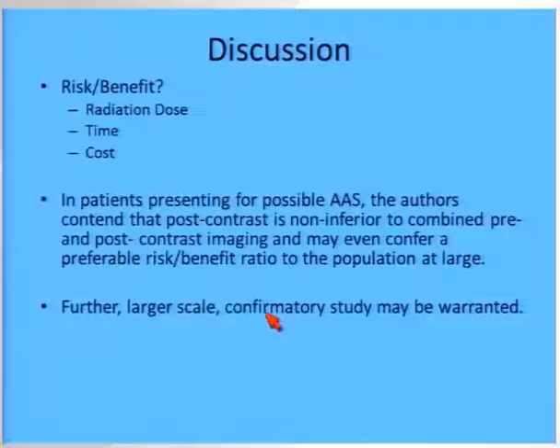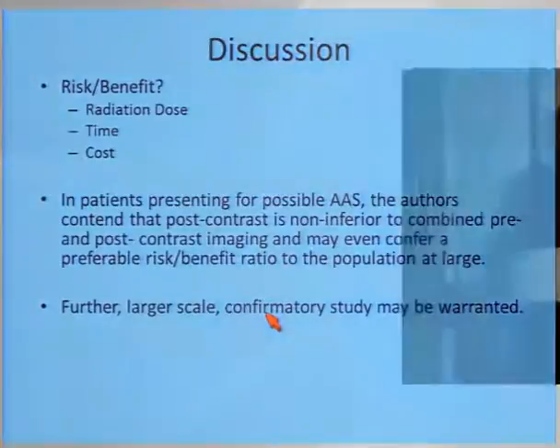I actually have a couple. The same question that we had asked Chris: did you look at the distribution of the intramural hematoma? Because sometimes the type A is a lot easier to see on the non-con. I was also struck by the fact that you said you had 5 thoracic radiologists who are fellowship trained. In our experience, the non-con is very helpful for the junior person and the non-chest radiologist reading. Did you look at that as well? Because I think many of us don't have chest radiologists taking call at night.